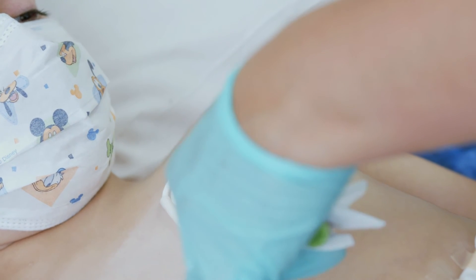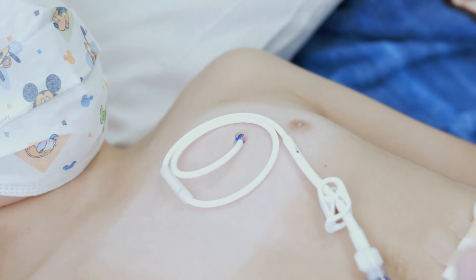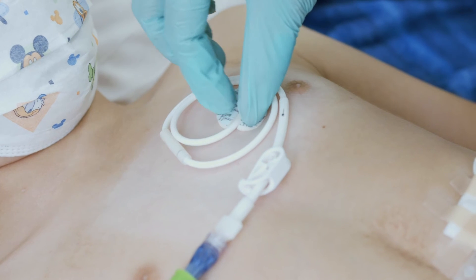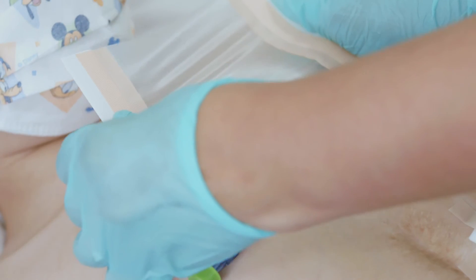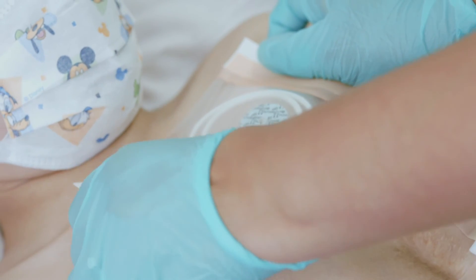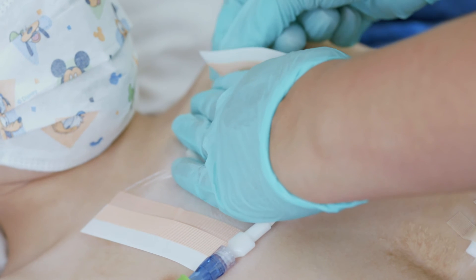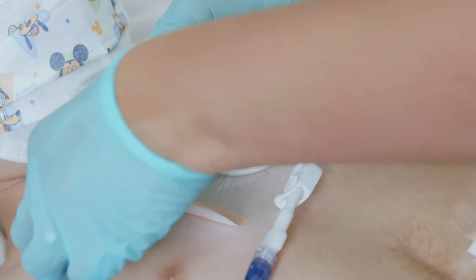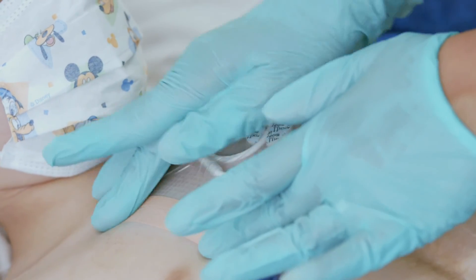If you can, make a small loop in the central line, keeping the line away from the ostomy, G-tube, or diaper area. Then apply the biopatch. Place the transparent dressing over the central line with the exit site in the center of the clear window. Press it lightly onto the skin, starting in the center of the window until it is secure. Remove the backing of the edges and press lightly on all edges. Make sure the edge of the dressing is sealed with the tape provided in the kit. Apply a securement device.